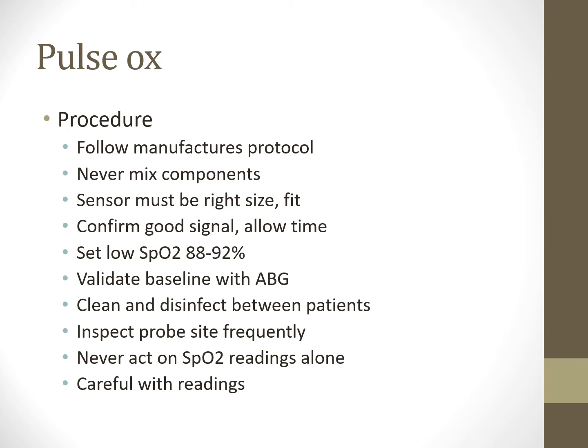I know in ICUs, if we're running severe ARDS and permissive hypercapnia patients, will run their pulse ox at 85%. So you have to sort of know what your SAT goals are for that patient that you're taking care of. No matter if they're in the NICU, PICU, or ICU, you need to be in good communication about the SAT goals as far as everything goes with your patient.